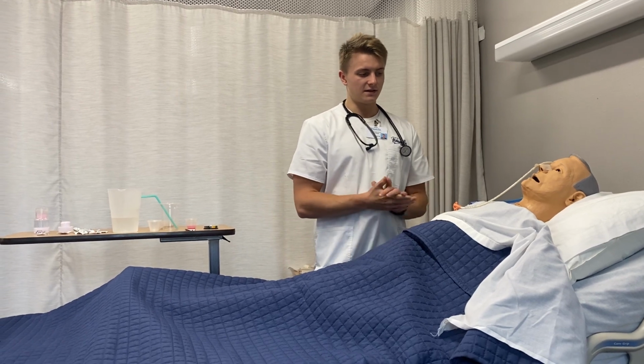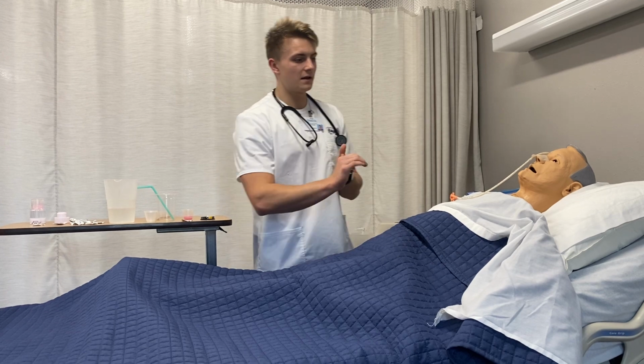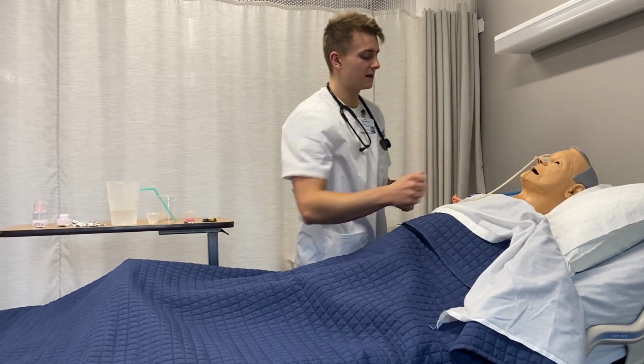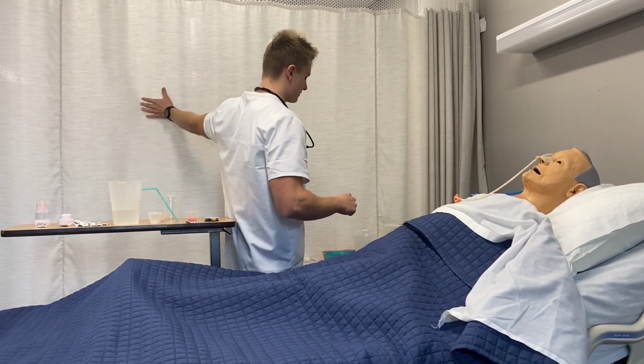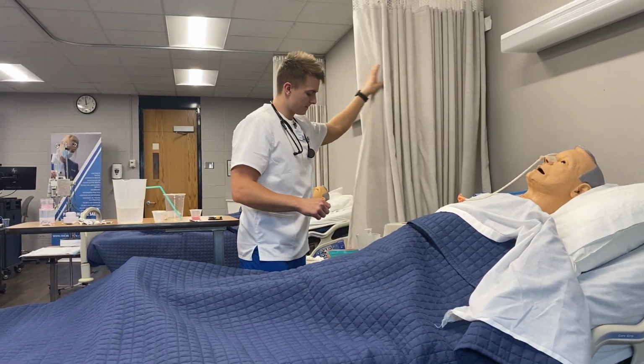I'm going to ask the client if he needs anything else from me. If he doesn't, I'm going to do hand hygiene. I'm going to put his call light right next to him. I'm going to remove the privacy.